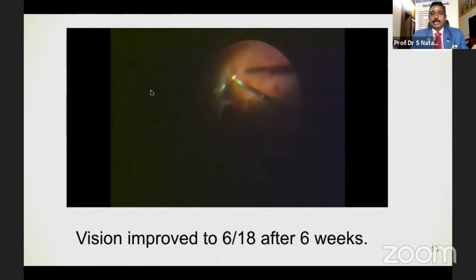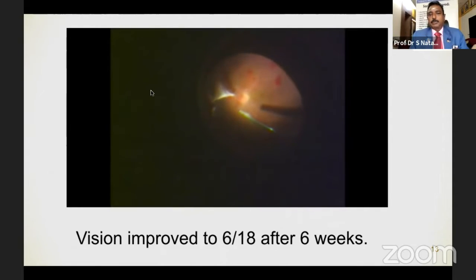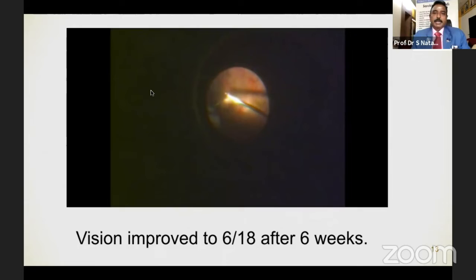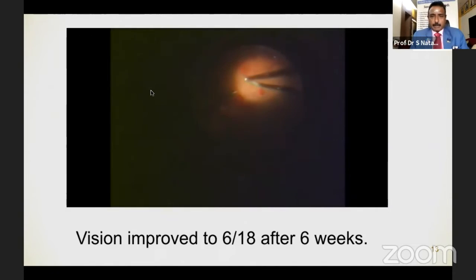You can see the vitreous hemorrhage is removed, and now the tangential traction is being relieved, and then you see the fibrovascular proliferation. I'm doing endodiathermy to make sure that bleeding does not happen. And I always keep the pressure at 20 and operate, because in diabetic eyes there's a possibility of the optic disc becoming pale. And you see, in spite of the diathermy, there is some ooze, but I think you can again trim it and then use the diathermy to coagulate the bleeding fibrovascular proliferation. And the whole idea is to remove the anteroposterior traction and the tangential traction. Still some retinal hemorrhage happens, which can be cleared using the retinal brush.